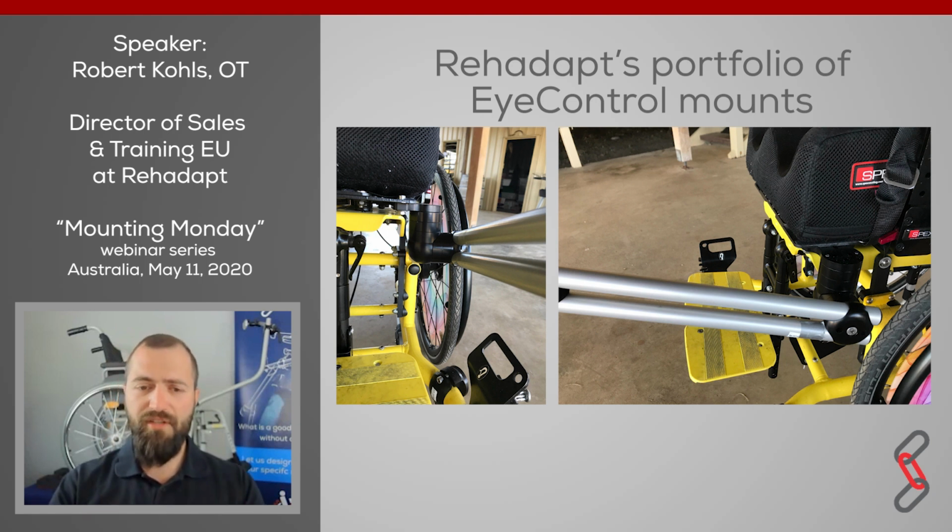As you can see on the left picture, it is connected with a 90 degree angle and the double tube base. When it comes to transferring the kid out of the wheelchair, we would in that case also need a base coupler to be able to remove the double tubes easily and quickly from the wheelchair.